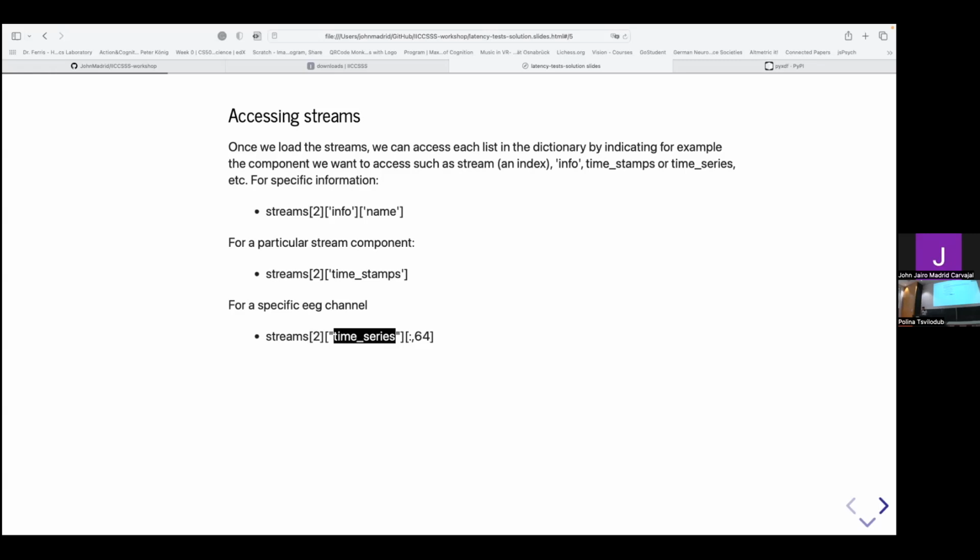I may just continue. I don't know how much time I have? Twenty minutes. Exactly. So we will likely not go over all of the exercises as I planned, but I can show you more or less how they should look, and maybe later on you can have a look at them and ask questions, because it's also really interesting to play with that data.